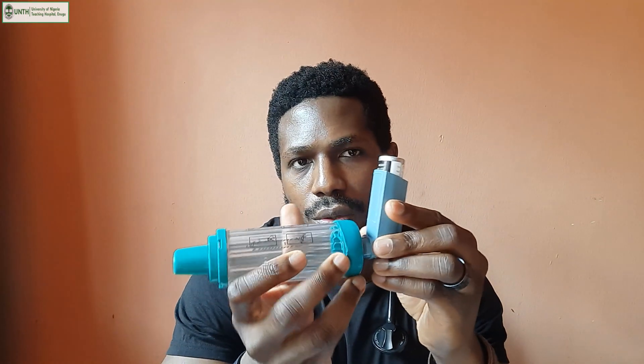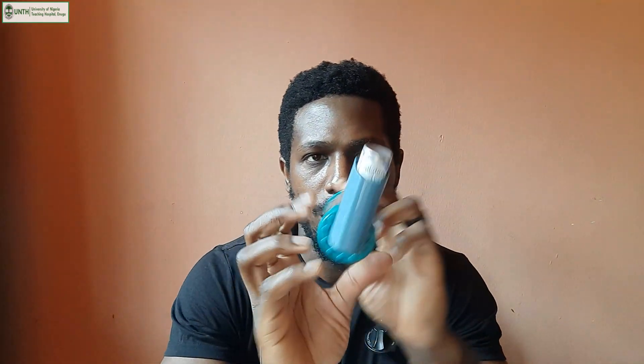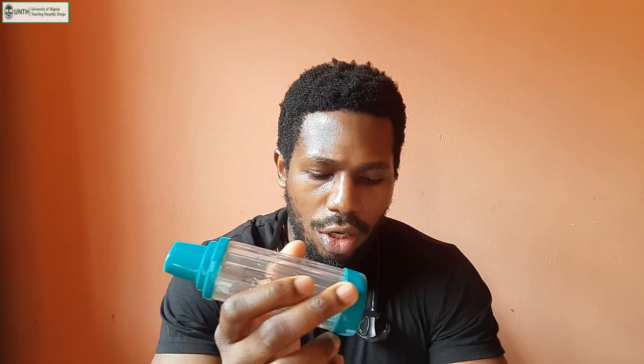There are some steps to confirm before using the aerochamber. Make sure there are no cracks on the glass aerochamber so that medication is not lost. Also confirm there are no foreign objects so you don't breathe in something else. Then confirm that the medication inhaler can form a tight seal with the opening — when placed there should be no gaps on the edge.